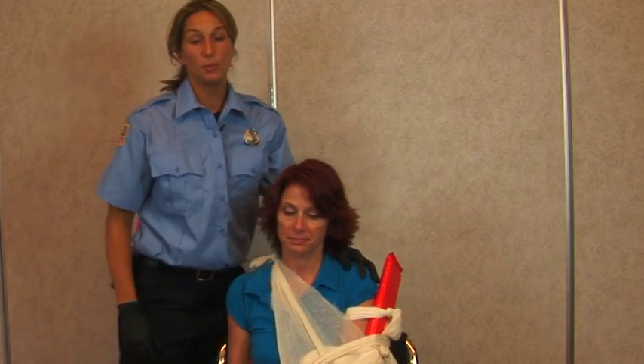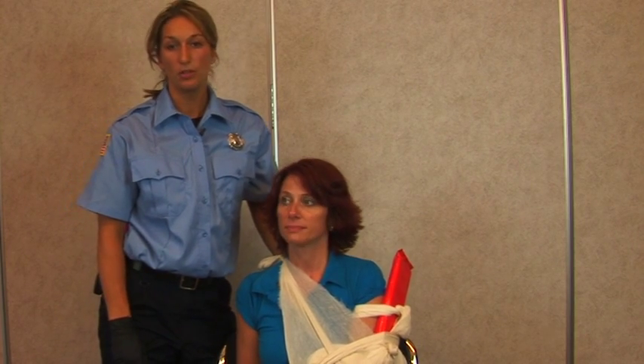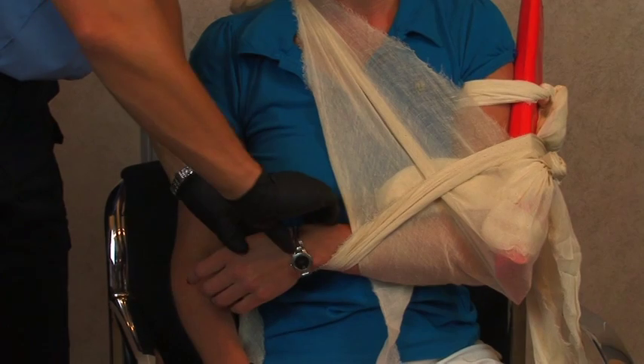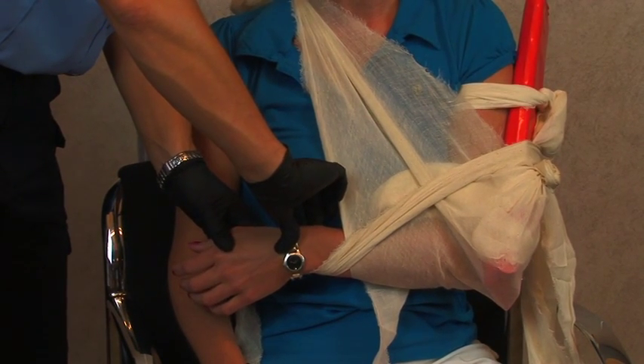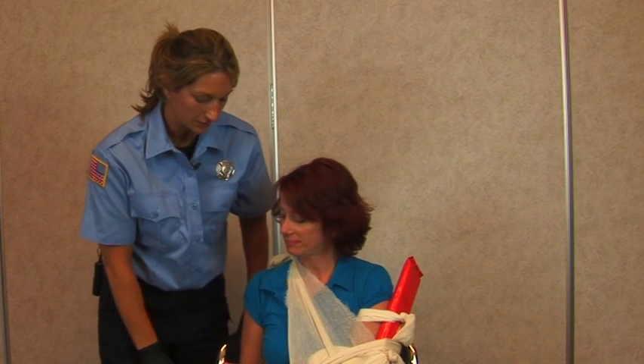It's very important before and after you apply the splint that you check for pulse, motor, and sensory. You can check a radial pulse. Can you feel me touching your fingers? And can you move your fingers please?